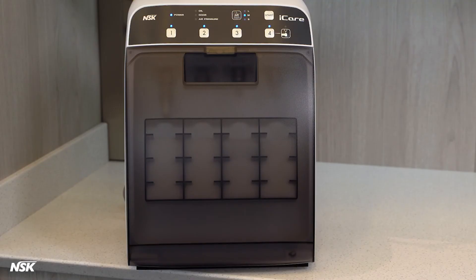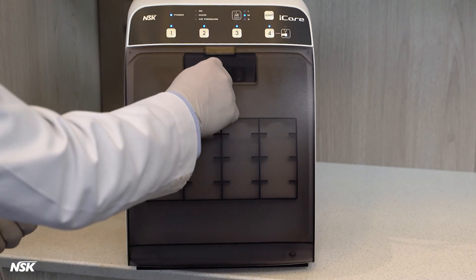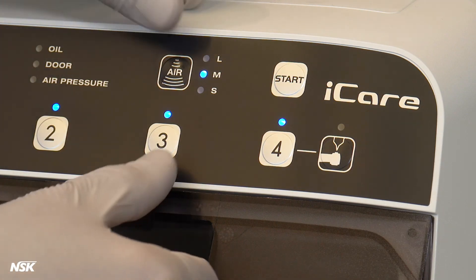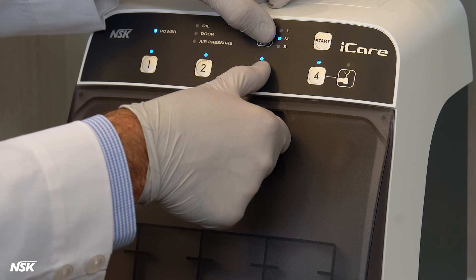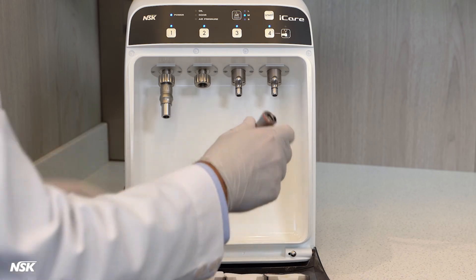Purging air only: if you notice a little excess oil left in the handpiece, you can purge extra air through it to clear out the excess oil. Connect the handpiece to one of the ports and close the door. Press the port button where the handpiece is connected and the air button at the same time for a few seconds. Pressured air will purge any excess oil out of the handpiece. Open the door and remove the handpiece.